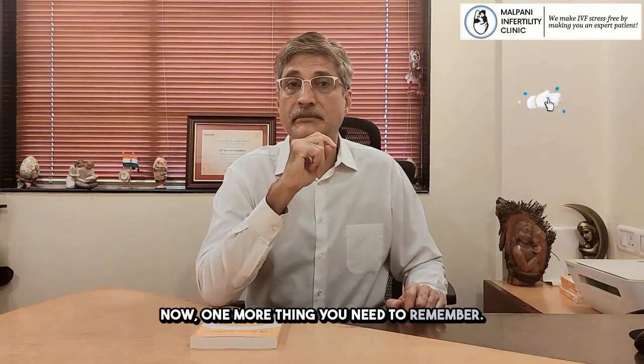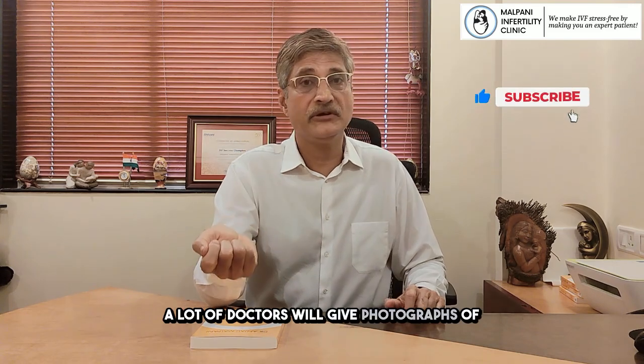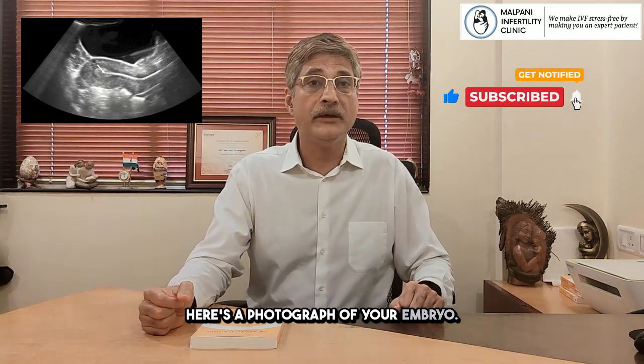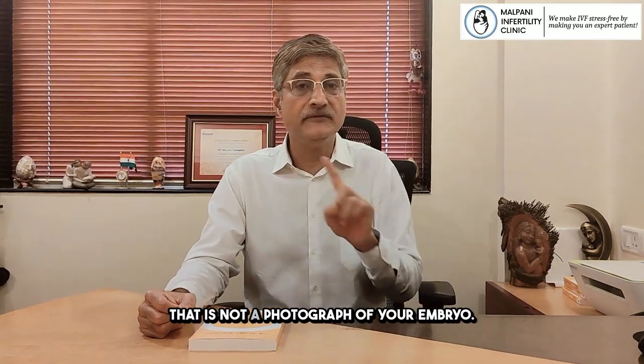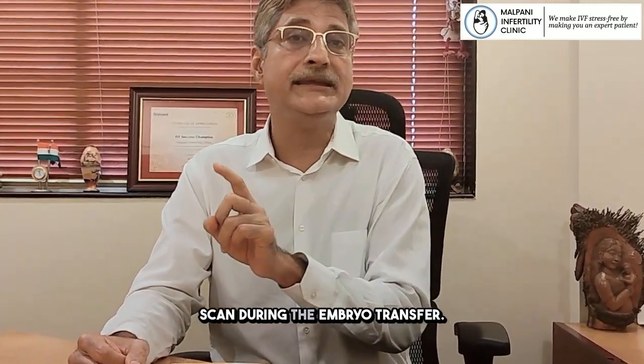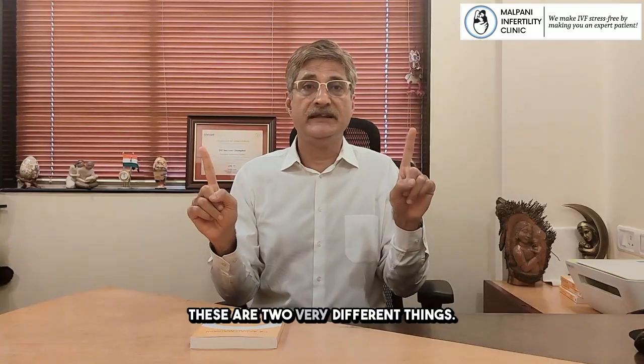Now, one more thing you need to remember, a lot of doctors will give photographs of the ultrasound scan and tell the patient, okay, here's a photograph of your embryo. That is not a photograph of your embryo. That's a photograph of the ultrasound scan during the embryo transfer. These are two very different things.